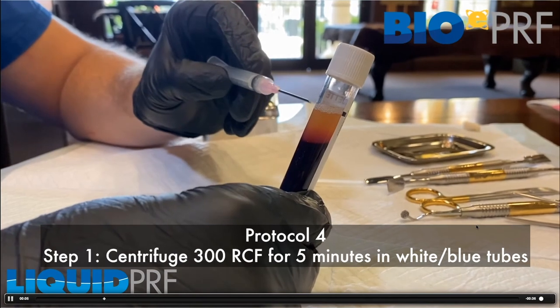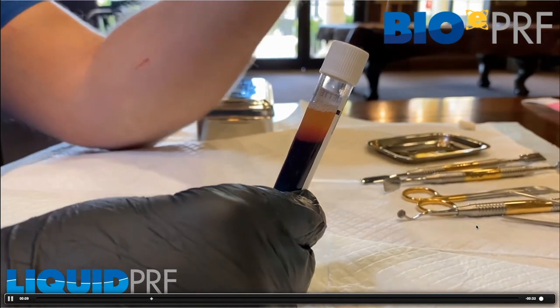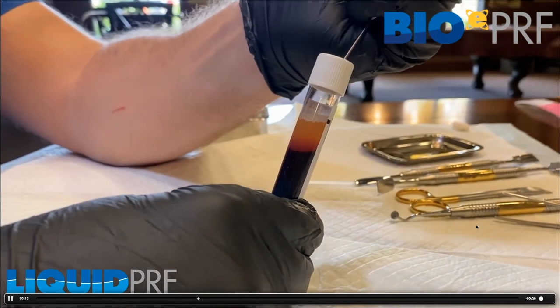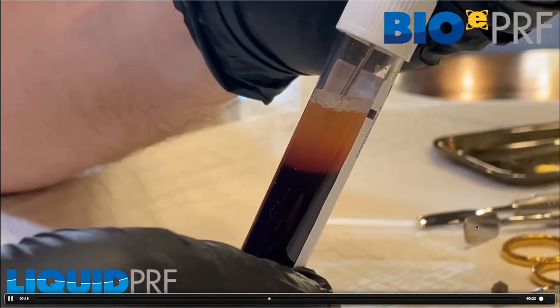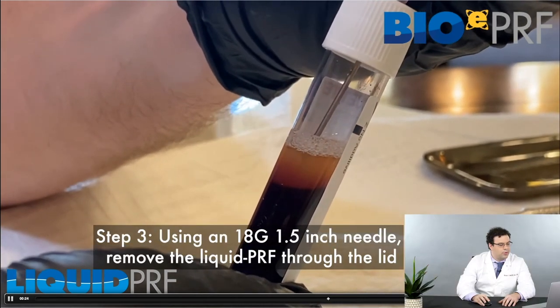You can see the buffy coat zone — that's where the cells are. In this video, you're going to pop through the lid. Once you're through the lid, you collect the liquid. You draw up the liquid, and when the liquid is drawn, we can use that.